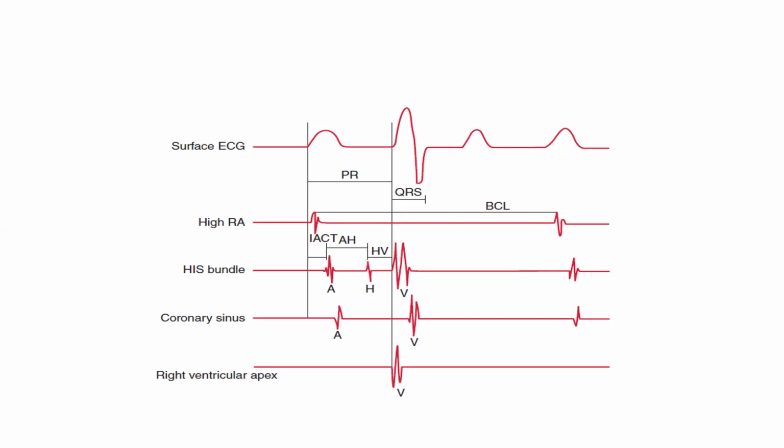Yes, Prof. So 60,000 divided by 800. What did you get? 75. So you can now understand why 300 divided by 4 boxes. How many beats will you get? 75. You now understand.